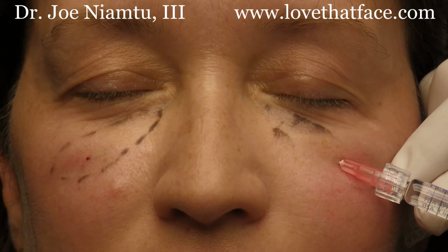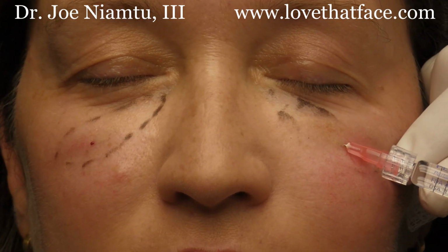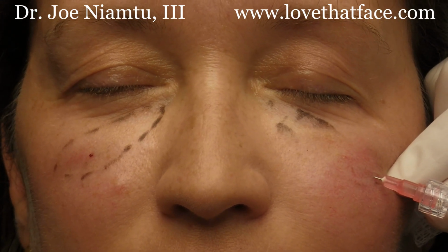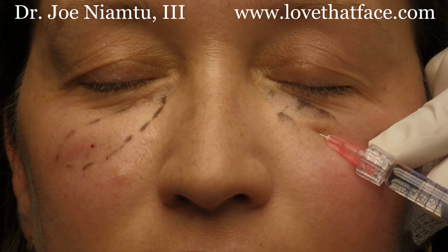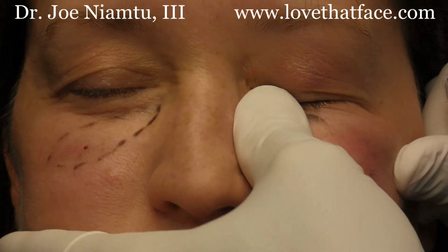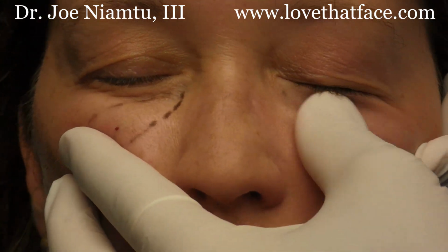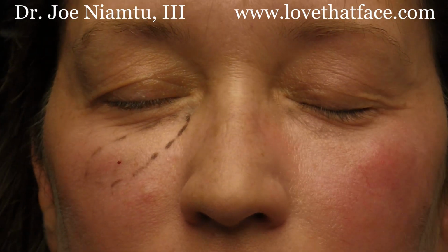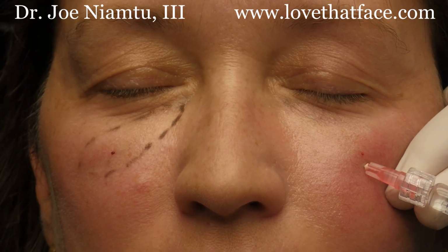We injected a little bit of 2% xylocaine, 1 to 100,000 in this region. I always numb my patients. I never inject anybody without numbing them. And our goal here is a multiplanar injection where we have a little bit of deep and a little bit more superficial and run a little bit right up into the tear trough. And we'll walk that over, put a little bit of Vaseline on there. And what we're doing is adding nice roundness to this area. And we're going from there to there, so to speak.